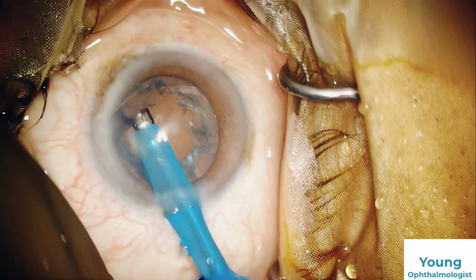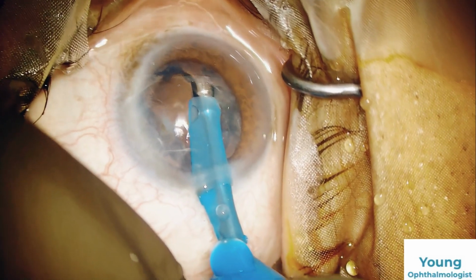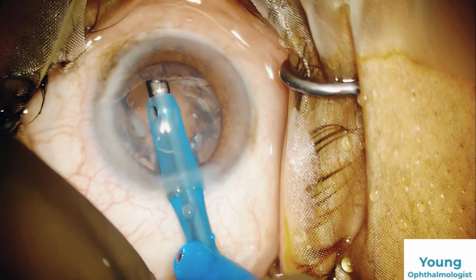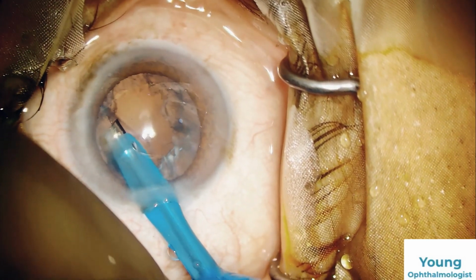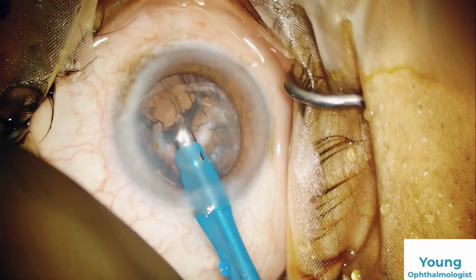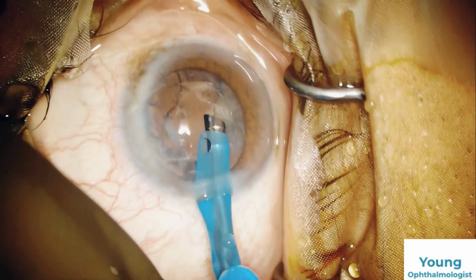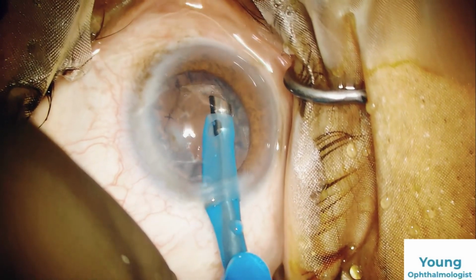As I am trying to aspirate the epinucleus, you can see it's going back. Again trying at some other quadrant, but again not very successful. Partly came, but still we have a large chunk of epinucleus and cortex in the back.